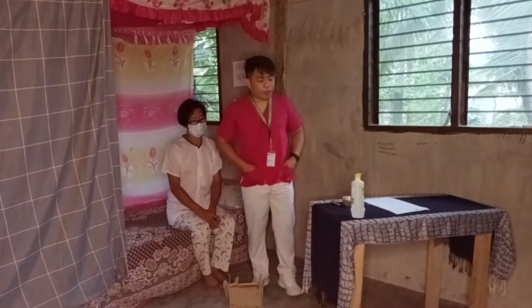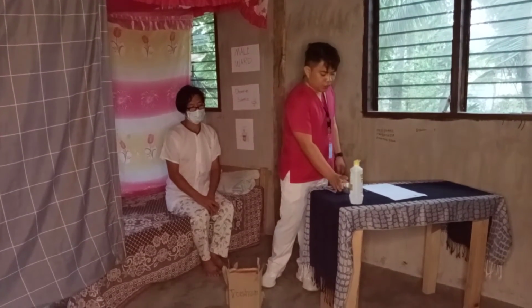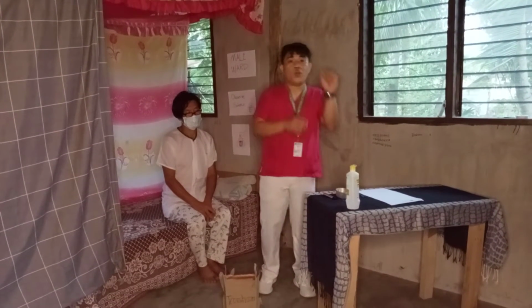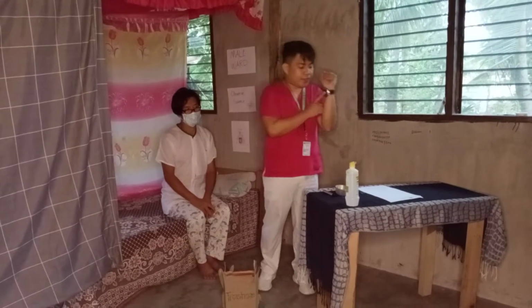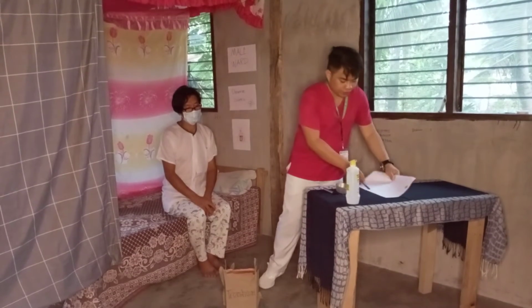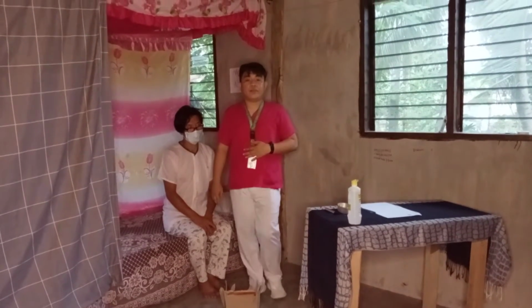Here are the equipment: axillary thermometer, cotton balls with alcohol, watch with a second hand, paper and pen. Now let's proceed to the procedure and the rationale.